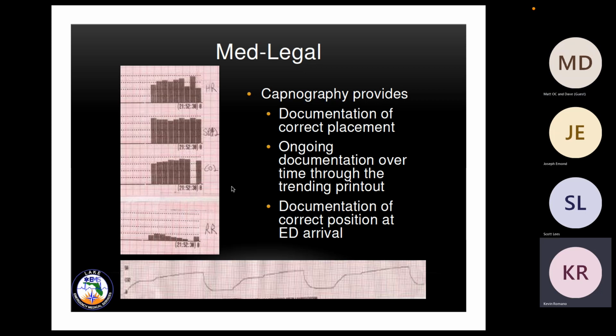Correct. Yes. Because every little bump you hit in the road, and I call it Z-fib for Zoll fib, it will recognize that, and then that would upload to your report, and your report would be like 80 pages long. So it only picks up the ones that you push, or anytime you do a shock, it does it as well. But if you get on scene to confirm a death, a DOA, right? Or you worked 20 minutes in asystole with no shocks, you've got to push the snapshot button on our monitors, or it's not going to save any of it. So that's one thing you remember to do.